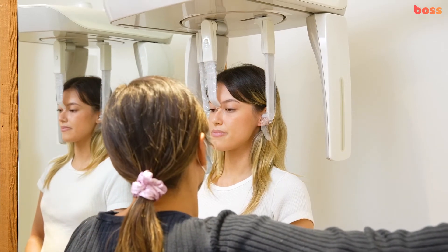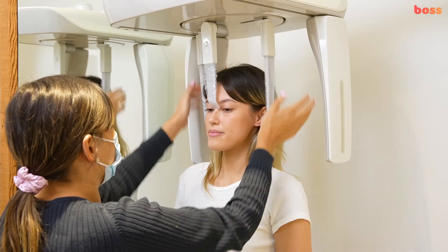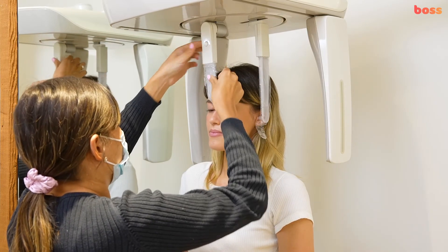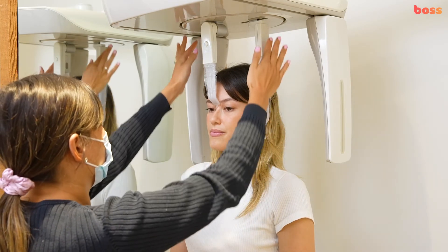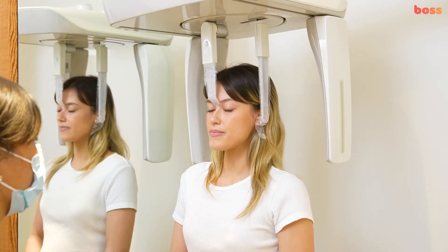Make sure there is protective plastic on the ear supports. When positioning the patient's head, set the equipment so that the ear rests are at the patient's ear height in their natural head position. Turn the nose support manually by adjusting it vertically and horizontally until the extreme side of the support is on the nose root to ensure maximum stability.